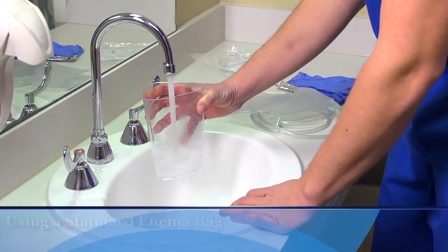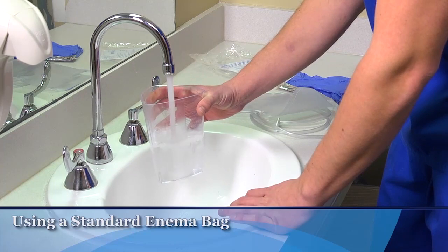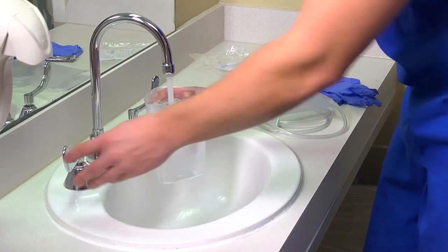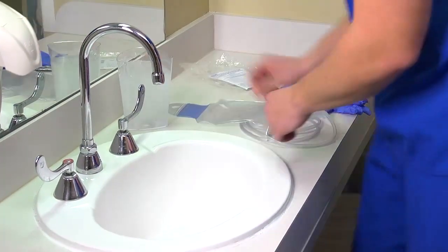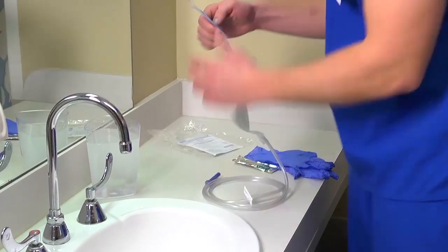To administer an enema using an enema bag, fill the bag with warm water from the faucet as prescribed. If saline has been ordered, warm the container of saline in a basin of water before you add it to the water in the enema bag. Then check the temperature of the solution by pouring a few drops on your wrist. The water should be warm but not hot.